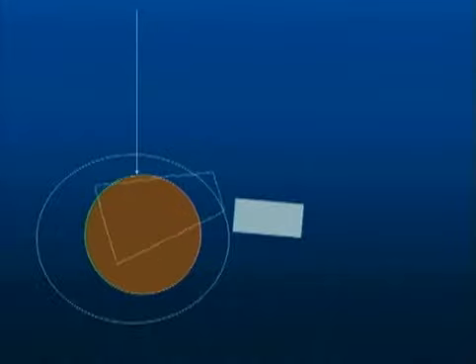If we set up and we're going to go ahead and biopsy a lesion, and we think we should place the needle in this plane, remember we may not see that entire shaft in this plane. What we may want to do is think about a plane in which we could go ahead, switch the transducer into a more ideal plane, rock the transducer in such a way that needle is perpendicular to the ultrasound beam.